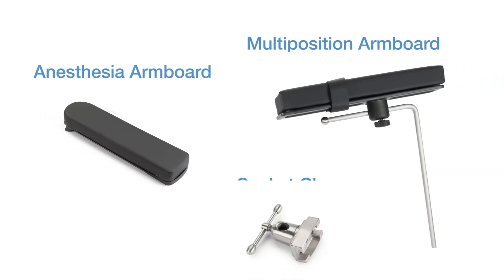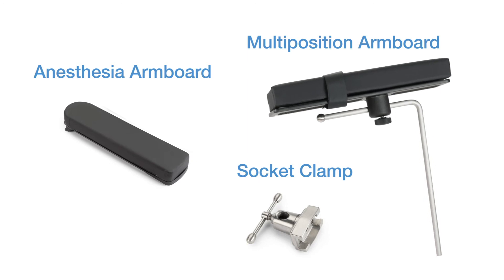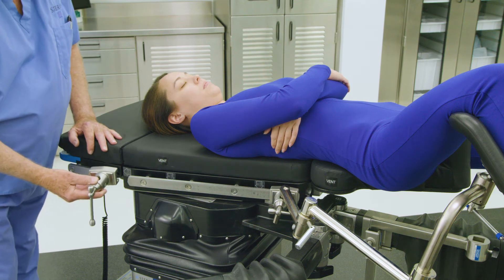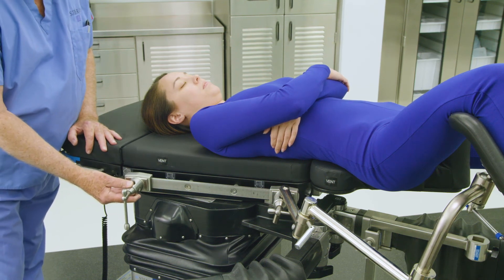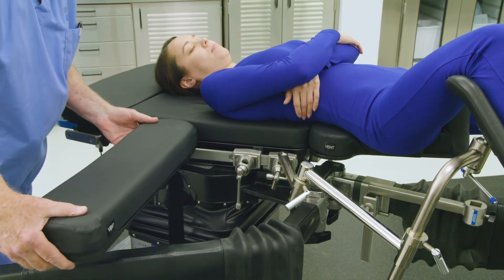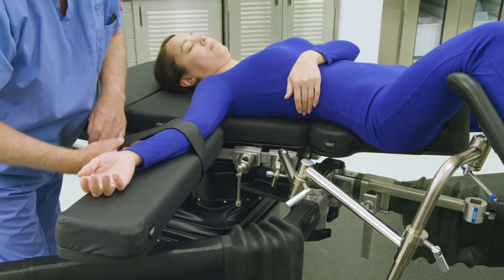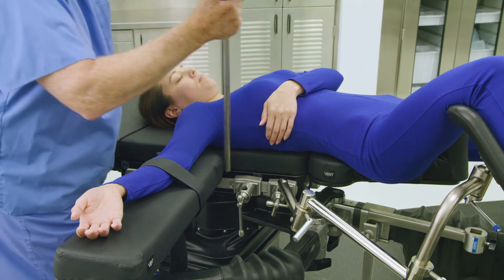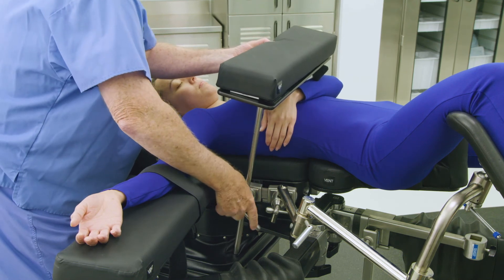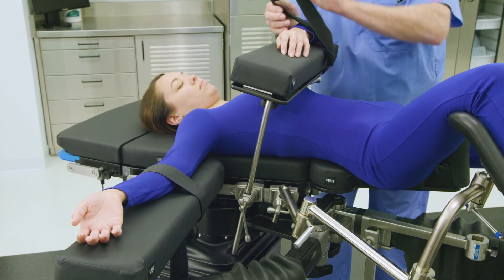The OT-1000 series table is equipped with both an anesthesia arm board to help position the arm on the non-operative side, and a multi-position arm board for the operative side, to ensure patient arms are properly positioned during the procedure. Before attaching an anesthesia arm board, first apply a socket clamp to the side rail on the non-operative side of the table. Next, apply the standard anesthesia arm board to the side rail on the non-operative side. Adjust as needed to accommodate proper arm position and apply the safety strap to secure the arm. Mount the multi-position arm board into the socket clamp, adjust the height and position above the patient's torso, and tighten the socket clamp to secure. Place the patient's operative side arm into the multi-position arm board and apply the safety strap to secure the arm.